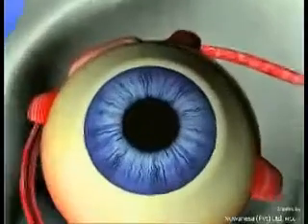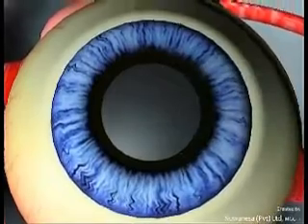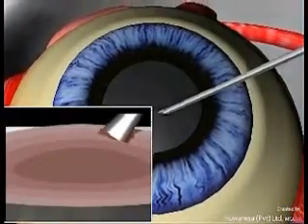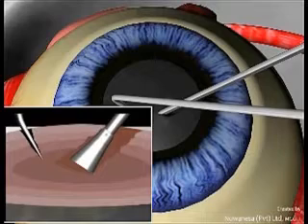This technique is for safe removal of hard cataracts. Once the capsulorhexis is made, the phaco is used to make a central hole up to 90% of the depth of the nucleus.